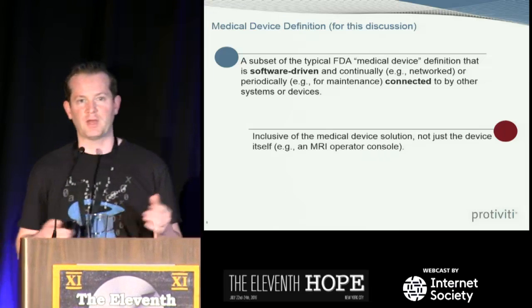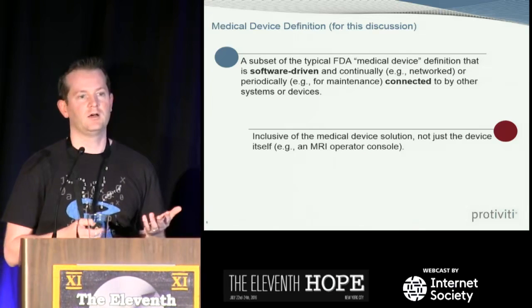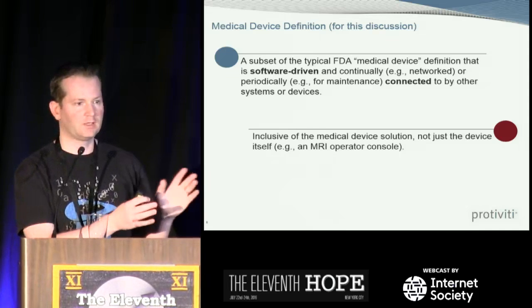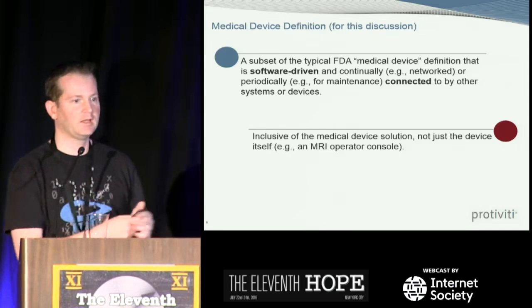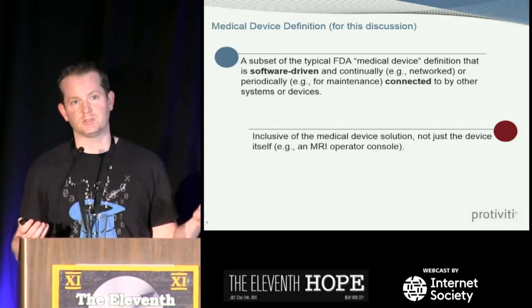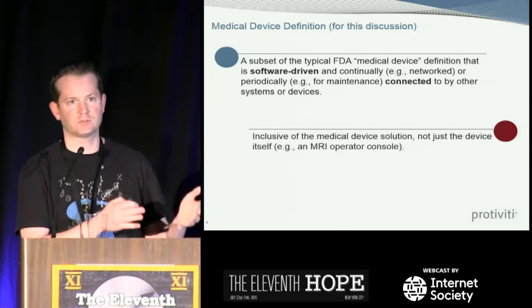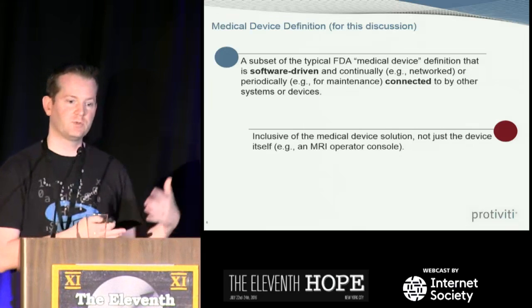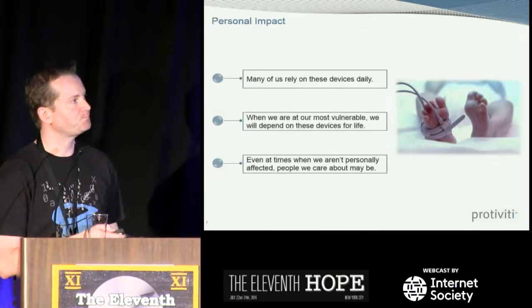Sometimes you'll think of just the actual physical hardware thing that's maybe running embedded Linux or a real-time operating system. We're talking about the entire solution. So if there's a device that's controlled by a computer and that's important for the function of that medical device, we include that in this definition.